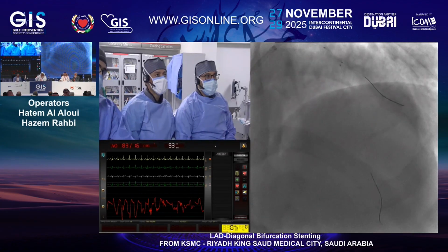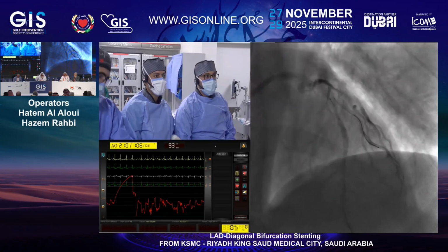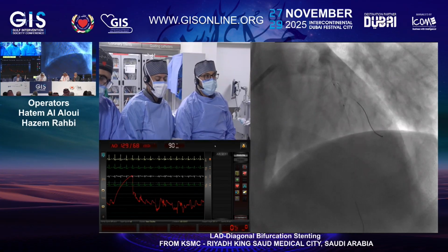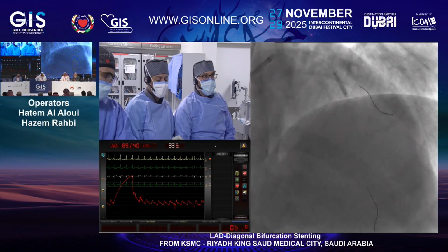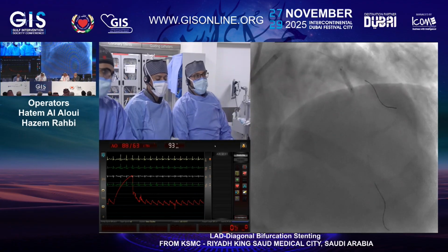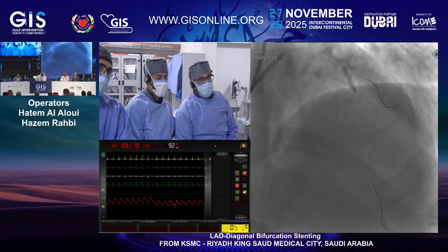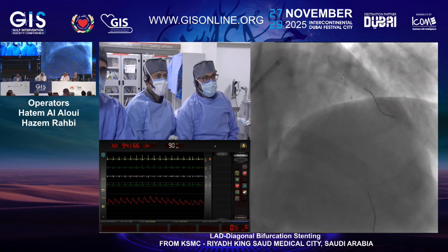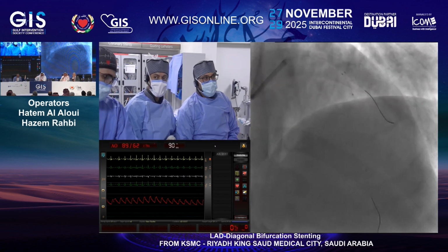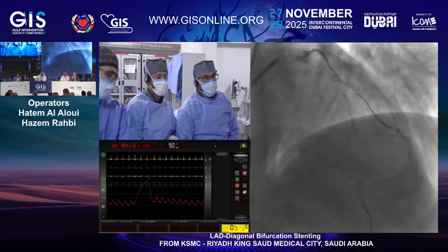So my question is, Dr. Hazem, this vessel, the 3.0 measurement with IVUS, is it lumen to lumen or media to media? Because it looks like a 3.5 to me. So let me answer you. The distal vessel, if we want to go media to media, okay, go up.